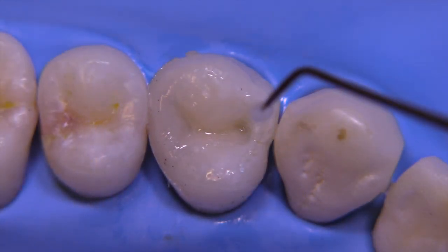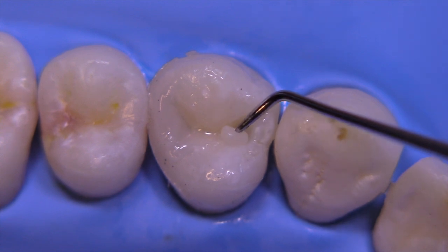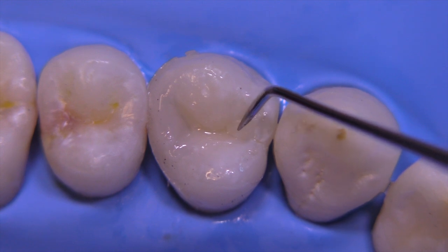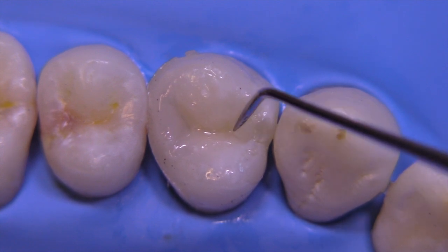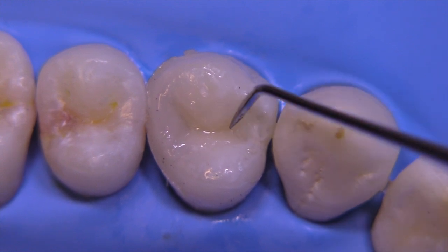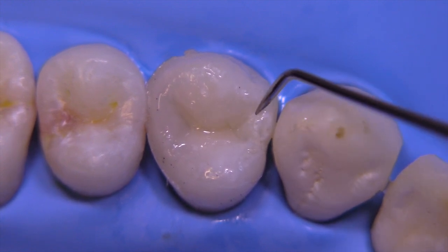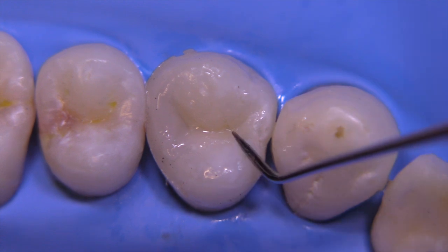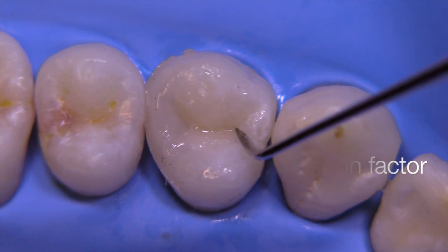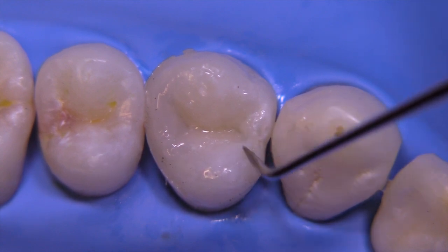After light curing this increment, we continue to build these increments. We're kind of building the lobes of the tooth — thinking like a little ameloblast, building up enamel in specific areas with the shapes the tooth wants to have. This also mitigates the issues with C-factor by building up your composite in this incremental manner. It's now under-contoured and not in occlusion at this point.